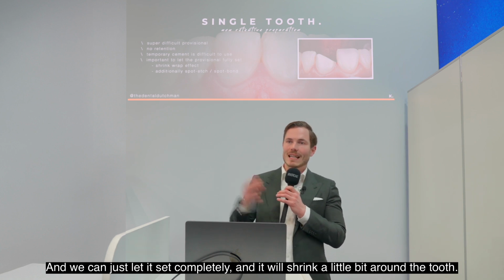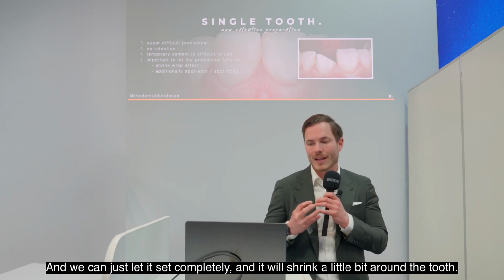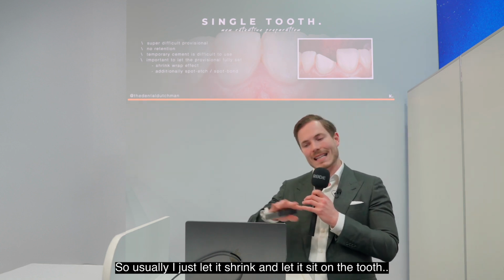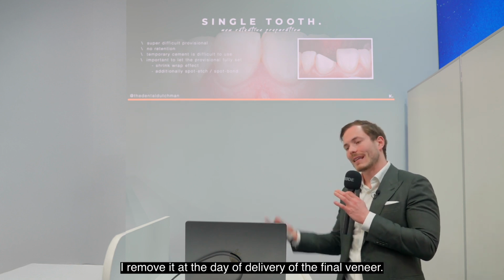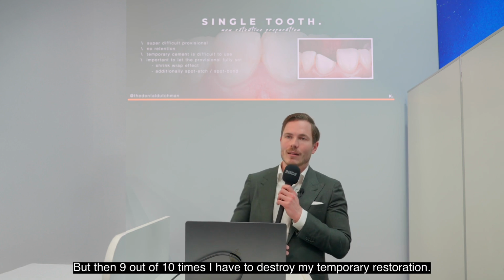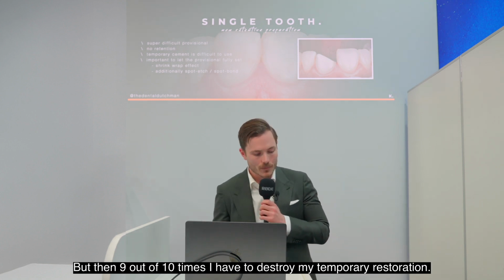And we can just let it set completely and it will shrink a little bit around the tooth. And then it will be difficult to remove. So usually I just let it shrink and let it sit on the tooth and I don't touch it anymore. I remove it at the day of delivery of the final veneer, but then 9 out of 10 times I have to destroy my temporary restorations.